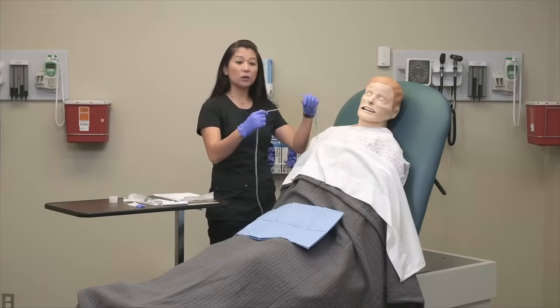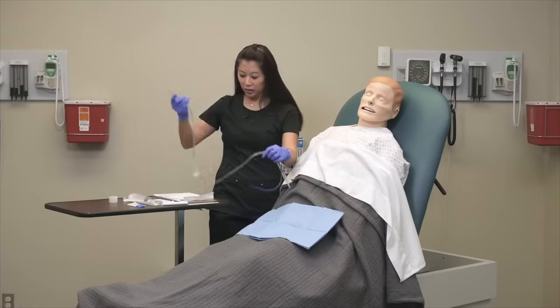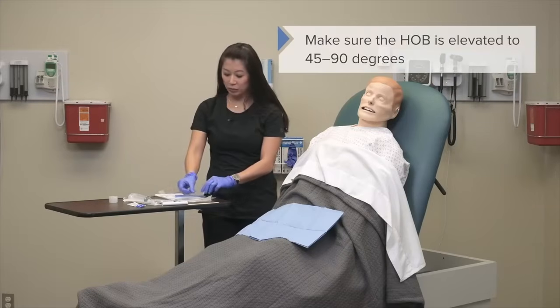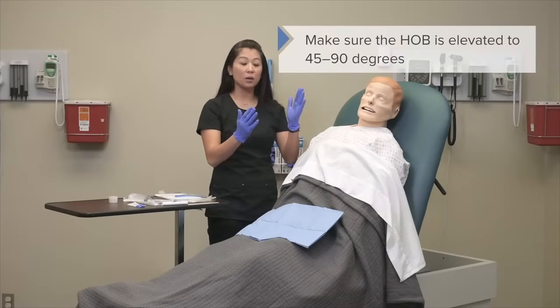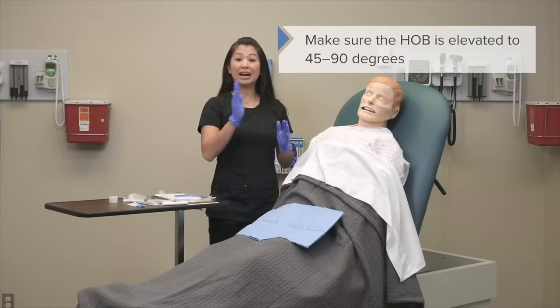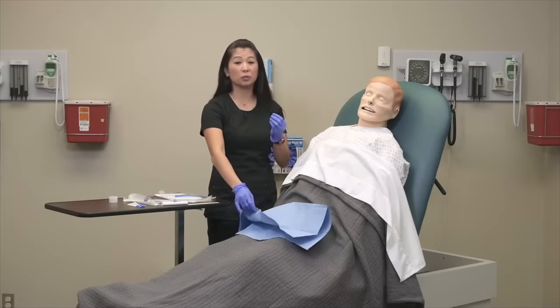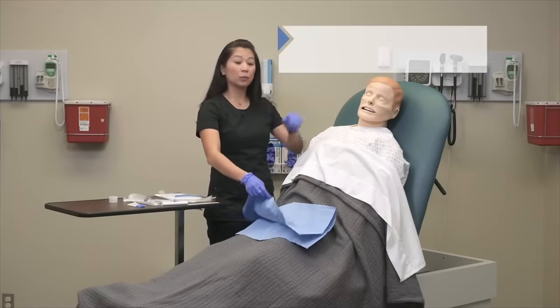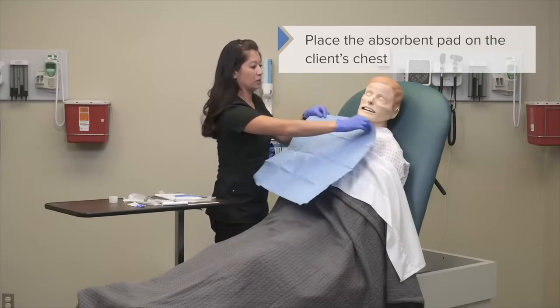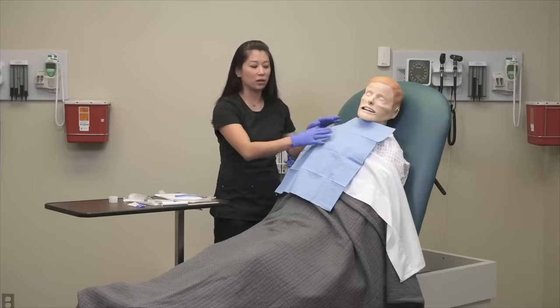Okay, so now that we've measured this, we're ready to go. The other thing is I want to make sure my client is comfortable. Notice that the patient's head of bed is up at least past 45 degrees. If they can tolerate it, 90 degrees is even better. The other thing is to know that there's secretions. We're going to be going down the nasal cavity, so I'm going to protect my patient as well and put an absorbent sheet over him. That way if they cough or sputter or anything like that, we don't get it on their gown.